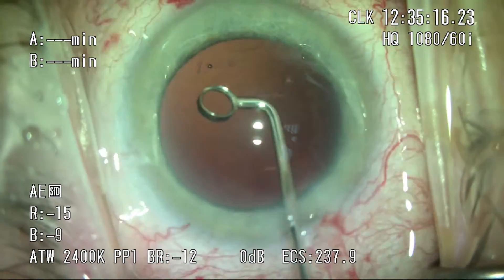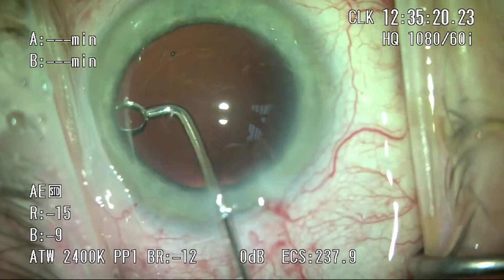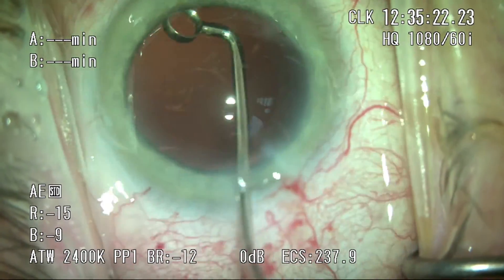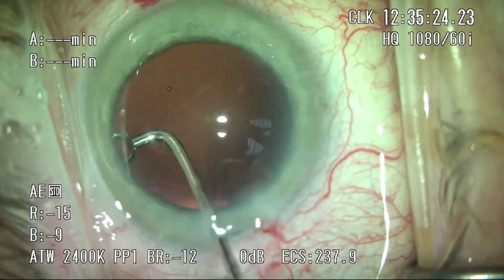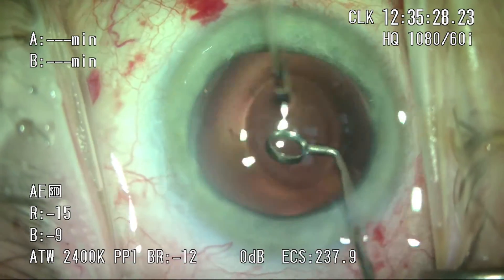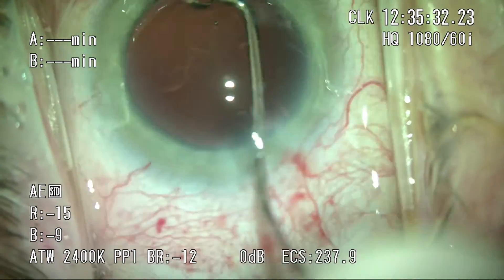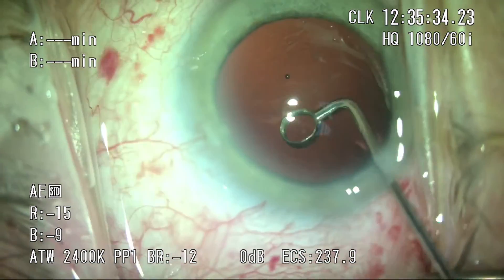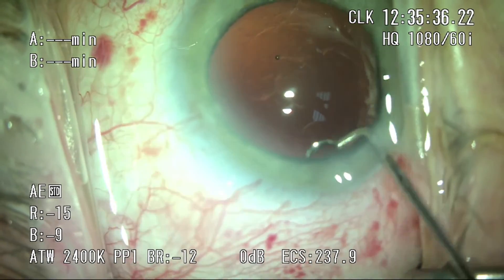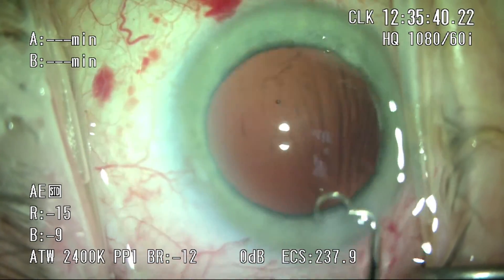Subincisional polishing with this device is a little tough, but with persistence you can get most of it. I also use a device called a Singer Sweep, which can go through both the main wound and the side incision to get the subincisional epithelial cells — though I'm not showing that in this video. I usually spend about two minutes on this per case on average, and I've seen the results — I'm convinced it's worthwhile doing.